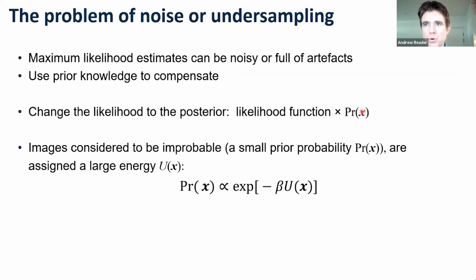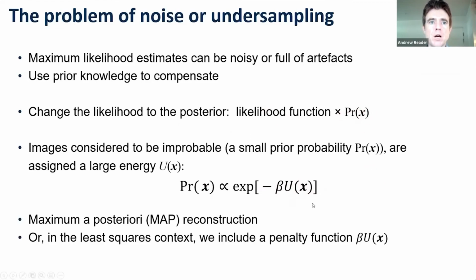which is the prior probability multiplied by the likelihood. So that's why we're defining it like this, knowing we're going to take the logarithm and just be left with this term here, which is basically like a penalty for the data fidelity. Okay, likelihood is data fidelity, and our prior is here. So when we take the log of that, and that's what we'll be doing, log posterior maximization, we can then view that as a penalty function.